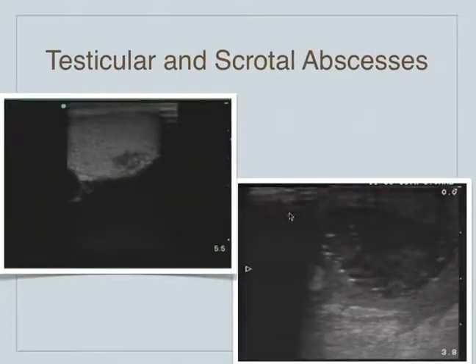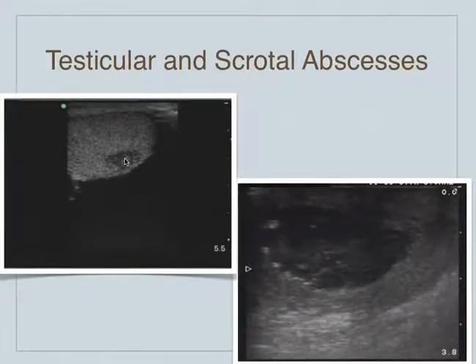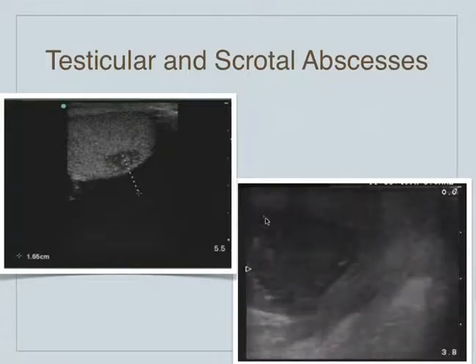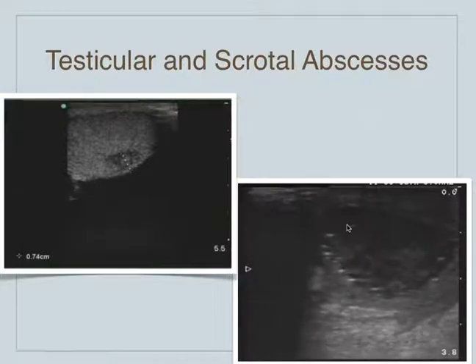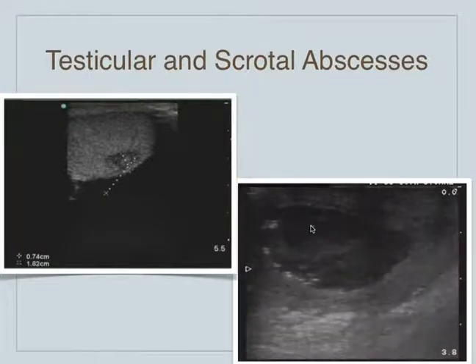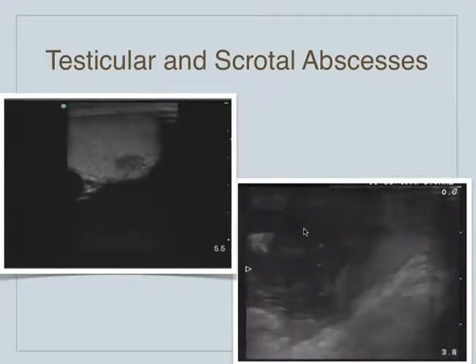We can see an abscess within the testicle itself — this hypoechoic debris inside the testicle is a testicular abscess. This is a scrotal abscess, which looks like any other abscess anywhere else in the body — this happens to be in the scrotum. When you have a scrotal abscess like that, it needs to be drained.